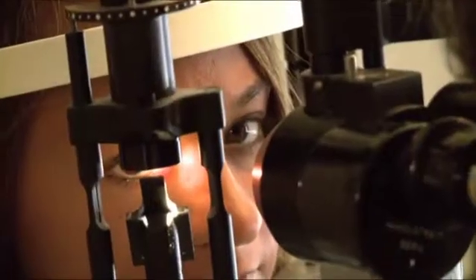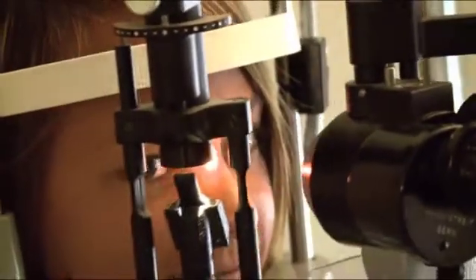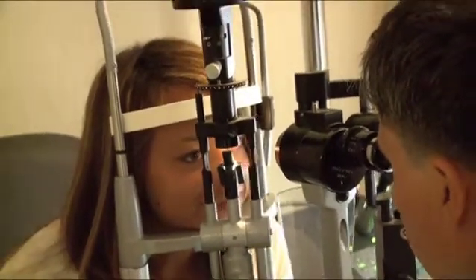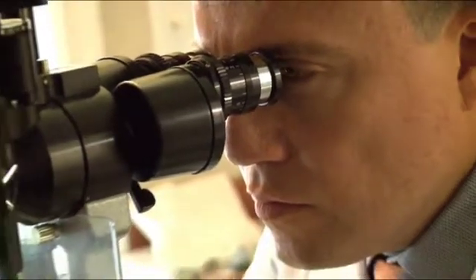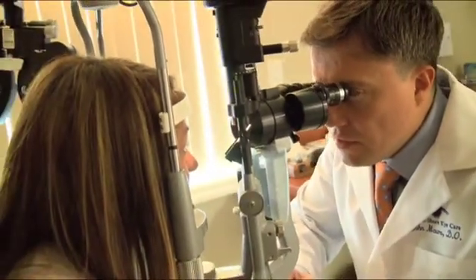After we do that, then we do a general eye exam. During this eye exam, we check the cornea. The cornea is the front of the eye, and the cornea is where all the action takes place, so to speak, when you have LASIK surgery. LASIK surgery, unlike cataract surgery, is not a surgery where we actually go inside the eye. LASIK surgery is done on the surface of the eye. So we do a lot of measurements.